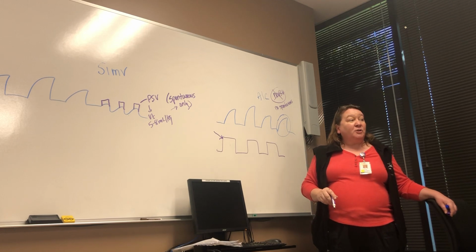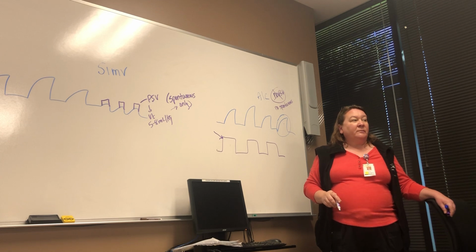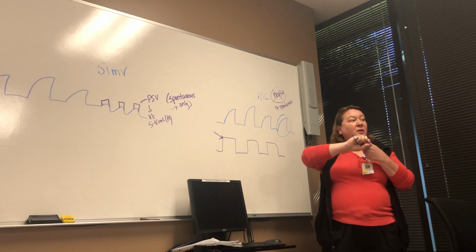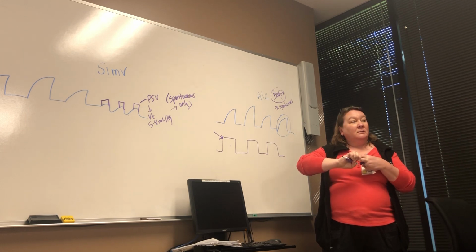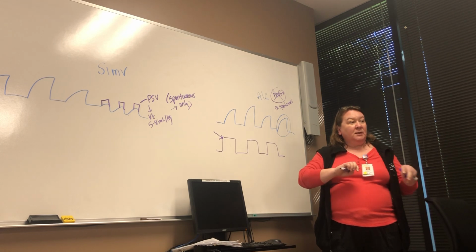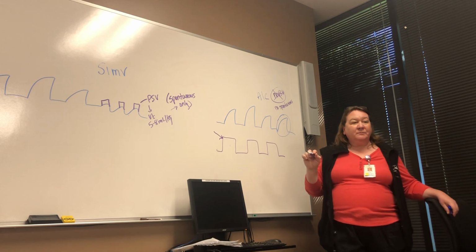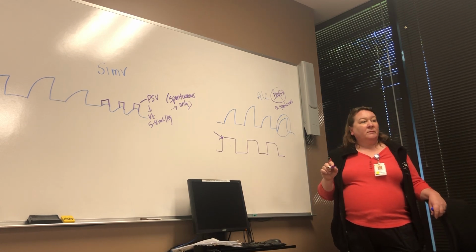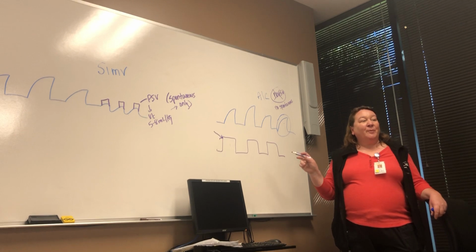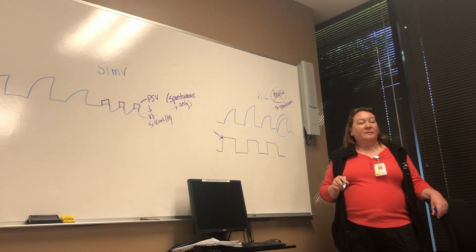So you can have pressure control and pressure support together. Because pressure control would be the pressure for the mandatory breath. Pressure support would be the pressure for the spontaneous breath. So pressure control is for mandatory breath. Yes. So is pressure control in AC or SIMV? Either one. Either one? Mm-hmm. So when you have both, it's SIMV and PC? Yes. Okay. She said when you have both, it's SIMV PC, because you would have pressure control with pressure support.